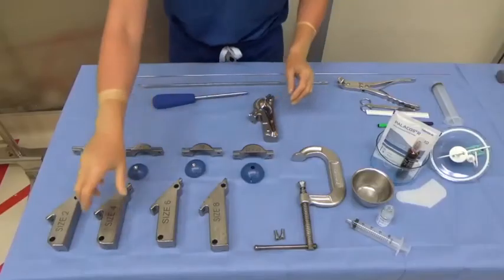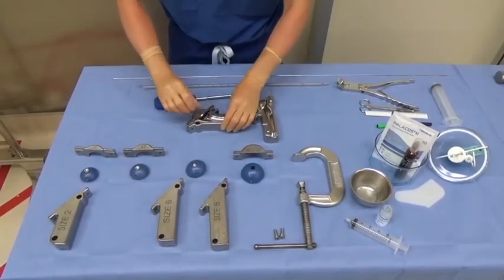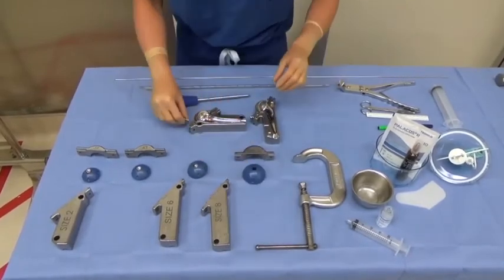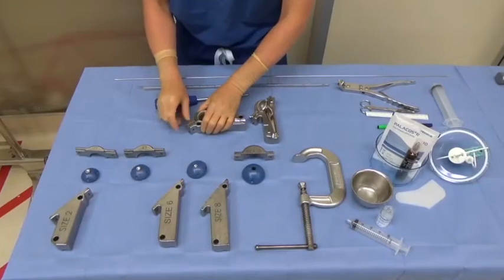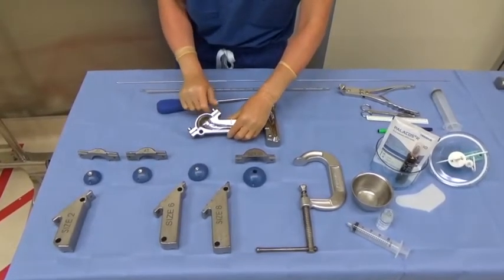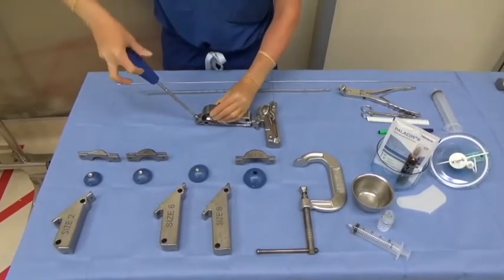Begin by assembling the humeral mold. The size of the proximal humeral mold is determined by broaching the humerus, placing a humeral trial, and taking the shoulder through a range of motion to assess component size and stability. In this case example, a size 4 long stem with a 48 x 18 mm humeral head will be used.